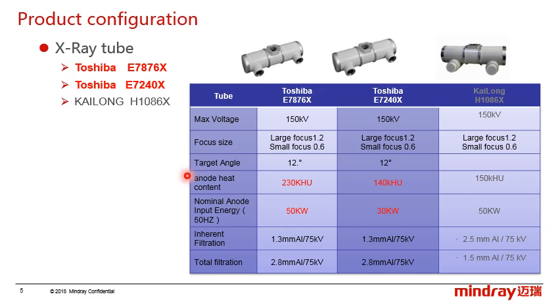Okay, the first part is about the configuration. There are 3 kinds of X-ray tube for DigiEye280: Toshiba E7876X, E7240X, and Kailong H1086. But this one has never been configured.